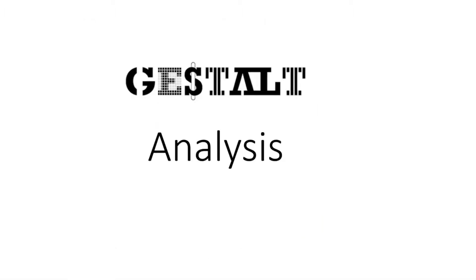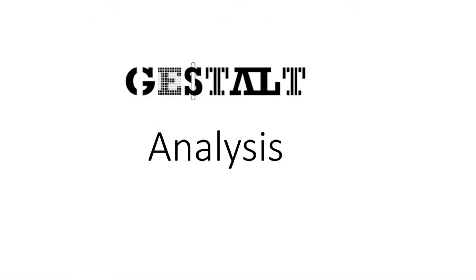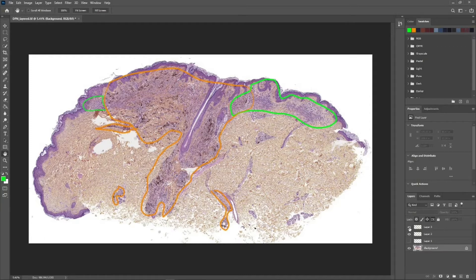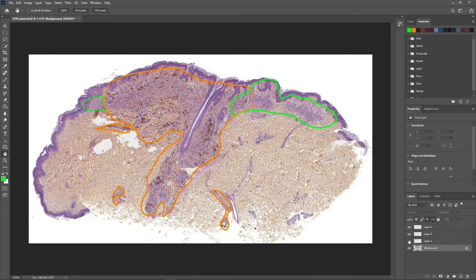Let's start with a Gestalt analysis. At low power, you notice there are distinct areas. One area resembles a common bland nevus, and there is another area surrounded by an orange outline — if I flicker, you can see there is a grid of melanophages in this area.